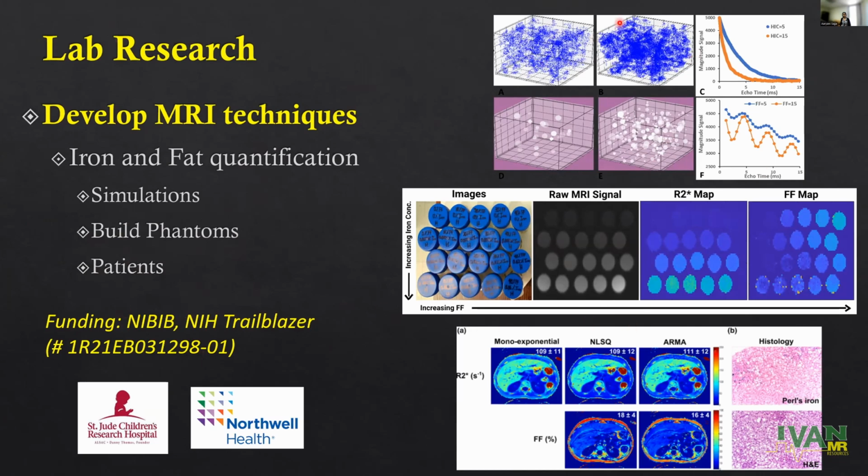What I mean by simulations is that we are creating our own virtual models because it's hard to get biopsy samples. So we are creating these iron overload models, and these are the synthesized MRI signals. And this is the fat model, and we are synthesizing the MRI signal.